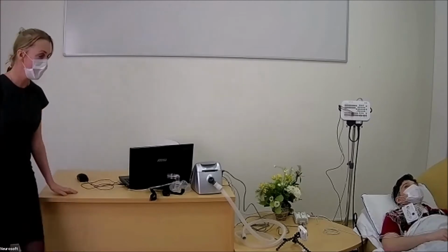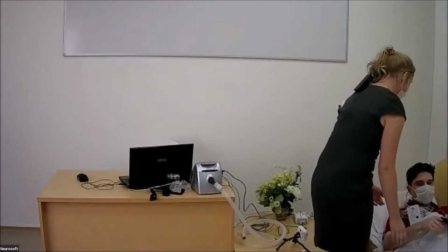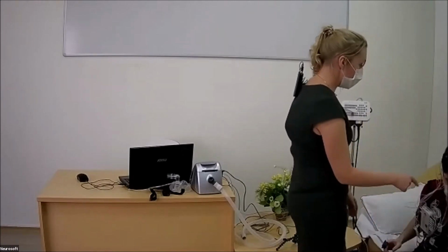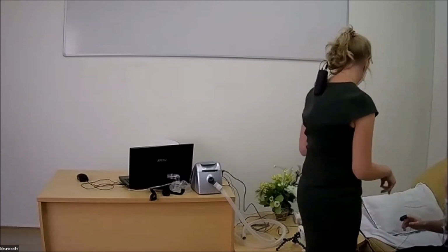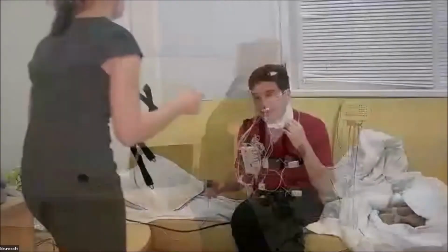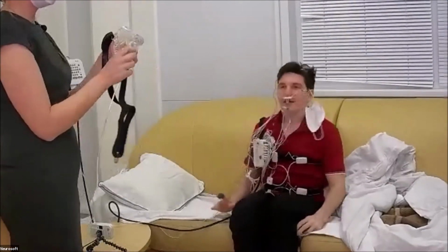And we wake our patient, so we ask him to take off the mask because we put our mask on his face.